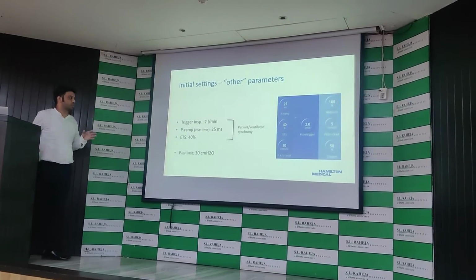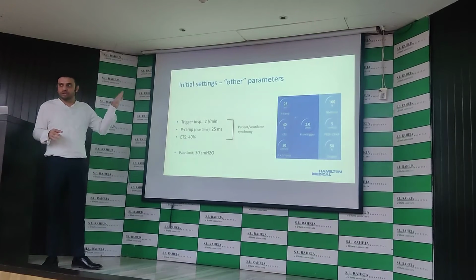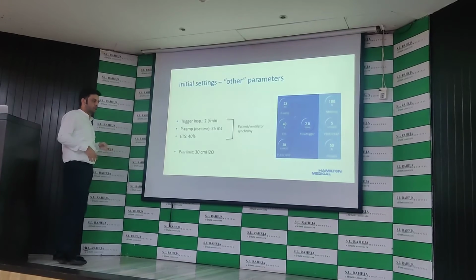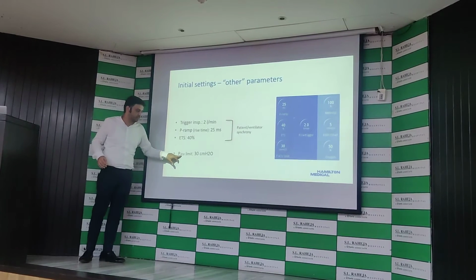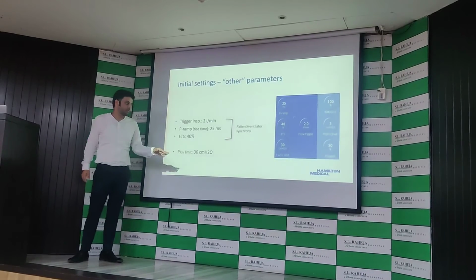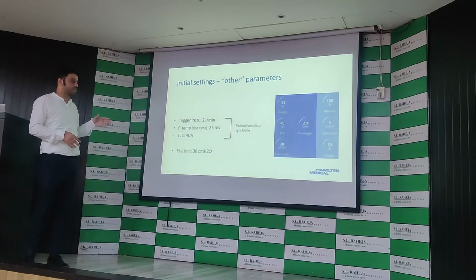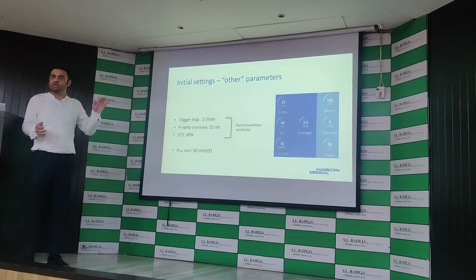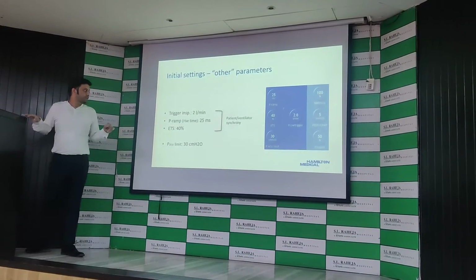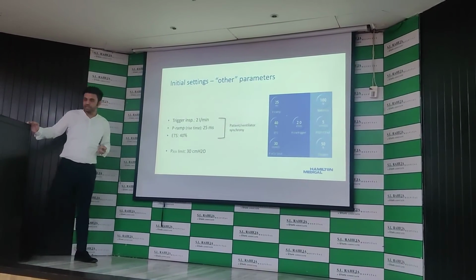So those were the three main control variables visible on the screen. If you go to those controls again, you will get other control options as well. One is the PASV limit, pressure ASV limit, which can be set around 30 centimeters of water. Suppose you want to set the alarm limit of the peak inspiratory pressure at 40 centimeters, which we usually set, then this ASV limit should be set around 30. Then we have of course inspiratory rise, then expiratory trigger sensitivity and the pressure range.